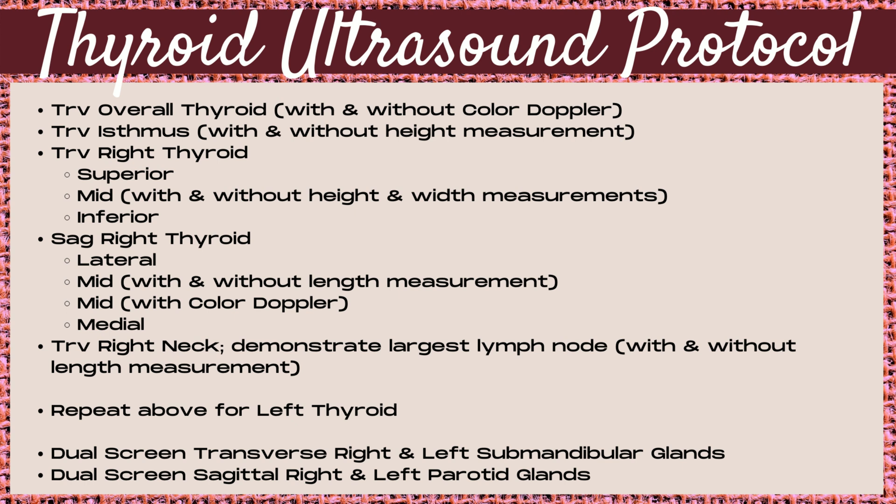Next you want to move on to the isthmus, and these images should be taken with and without an AP or height measurement of the isthmus. Then move on to the transverse right lobe of the thyroid, taking images of the superior, mid, and inferior portions. For the midsection, take images with and without height and width measurements.